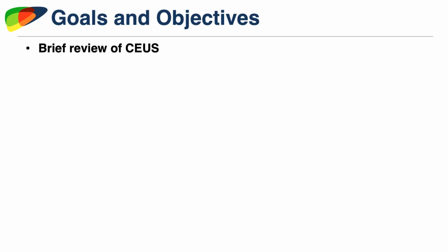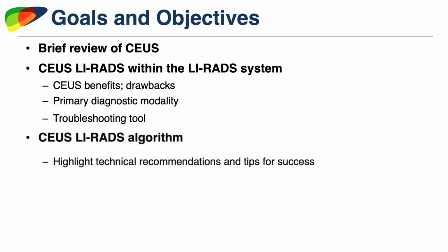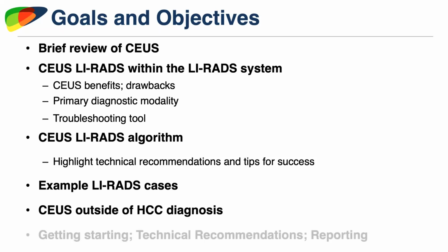For our talk today, we'll briefly go over contrast enhanced ultrasound as a modality for those of you who may be new to it. We'll talk about how contrast enhanced ultrasound LI-RADS fits within the larger LI-RADS system. We'll go into some of the details about the contrast enhanced ultrasound LI-RADS algorithm itself. I will present some examples and then even talk about contrast enhanced ultrasound outside of HCC diagnosis. Keep in mind that there's a lot online about getting started, technical recommendations and reporting and so forth that we won't be talking about today.